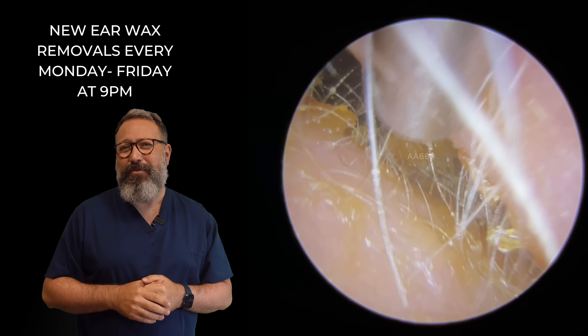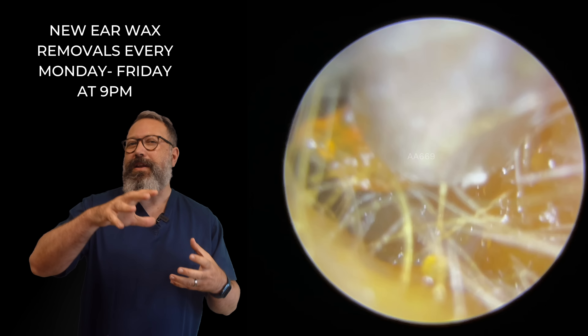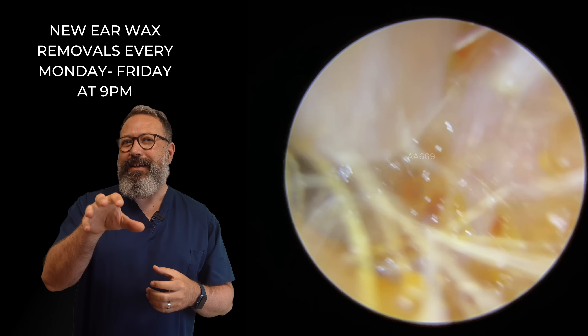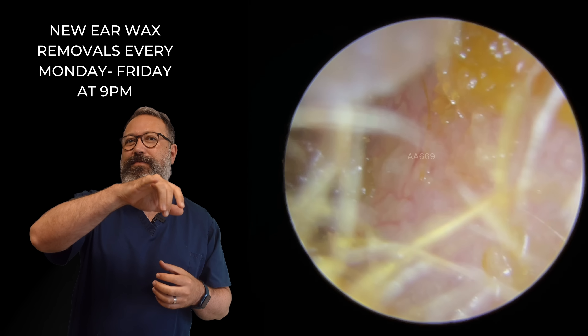So we've got to try and get through this little narrow gap here. When the wax is nice and really solid, it means it's going to get through that gap really easily. When it's crumbly and that little bit drier like it is in this particular case, what you'll find is as you start to bring this down the canal — we get a grip on this piece of wax. There we go. Just lift it off the canal there.